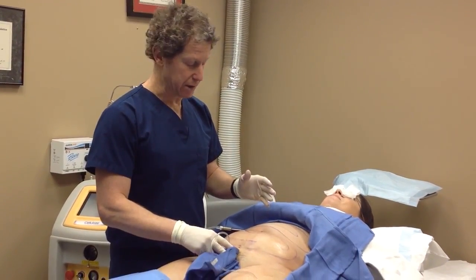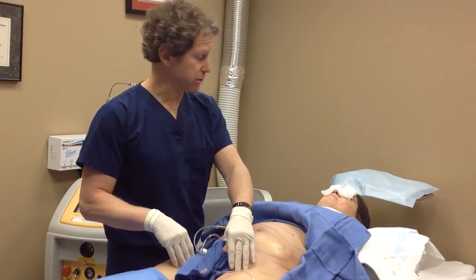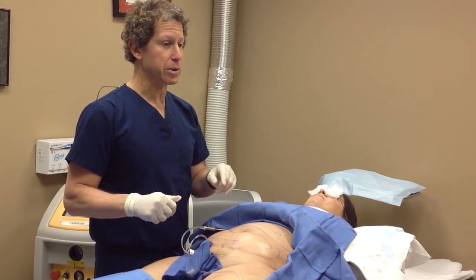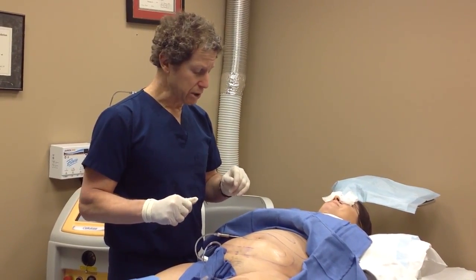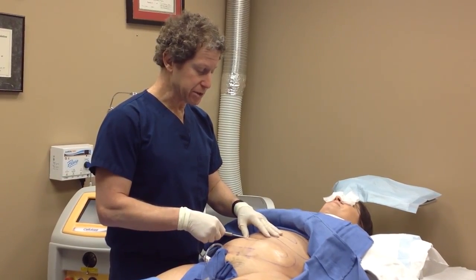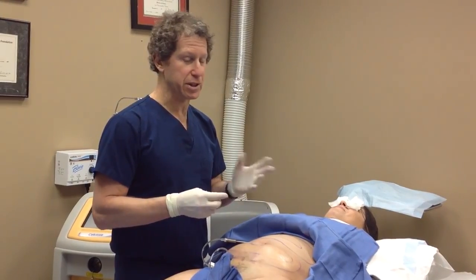Today we're going to do four areas: her lower abdomen, upper abdomen, both inner thighs, and — like a lot of women — she has a little fullness underneath the neck area. The cannula is underneath the skin, infiltrating. As she can tell you, it wasn't painful — just more of an unusual feeling.